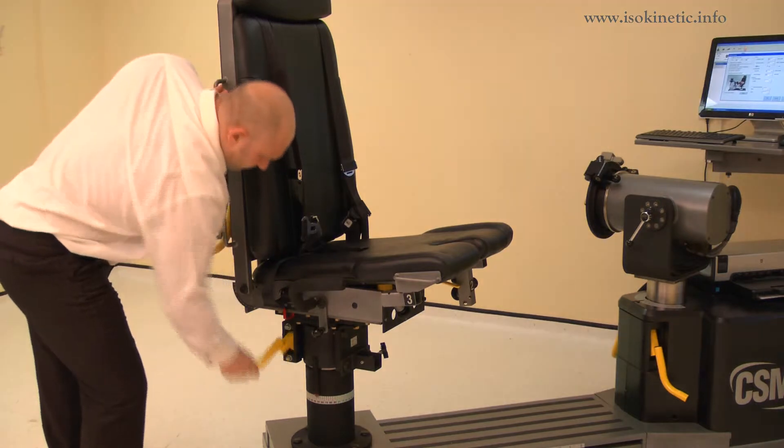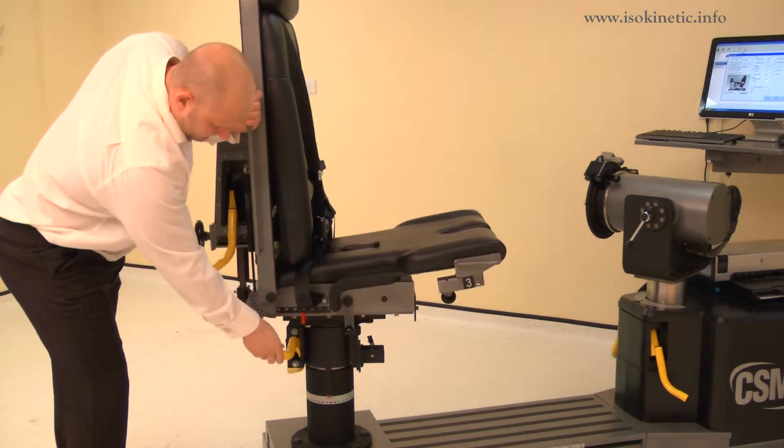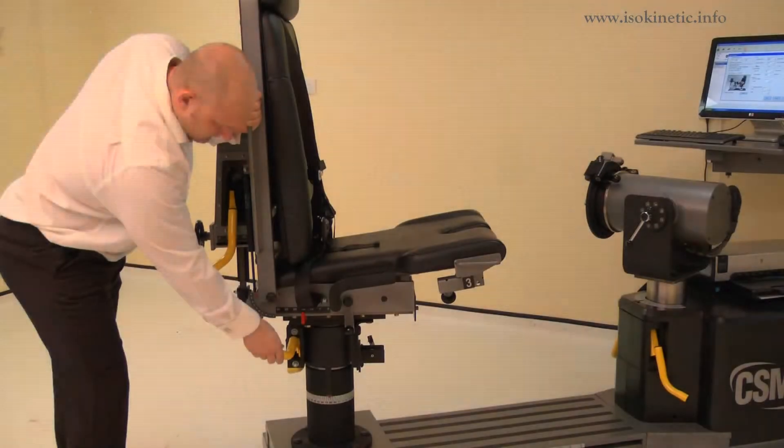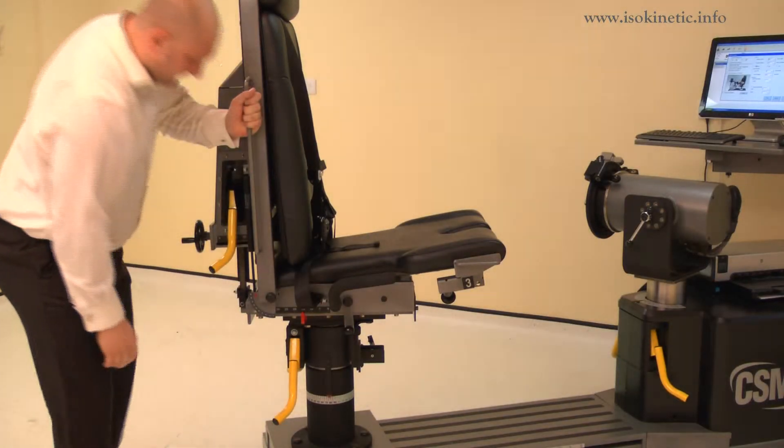Now adjust the chair rotation. Lift a locking handle and rotate the chair to 80 degrees on the green scale. Ensure both locking handles are pushed down to secure.